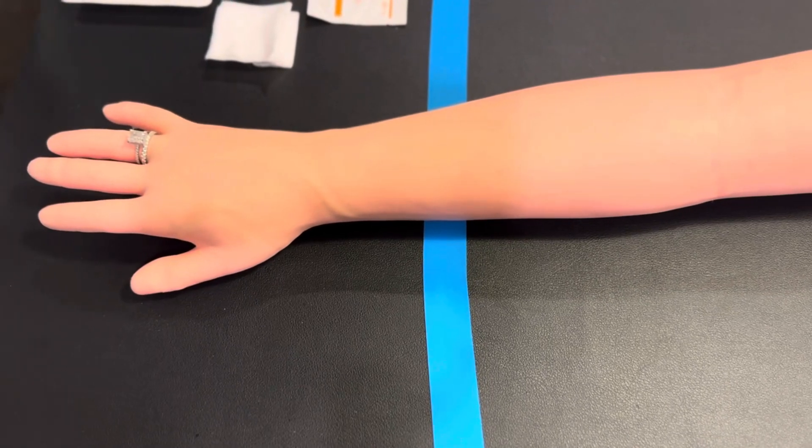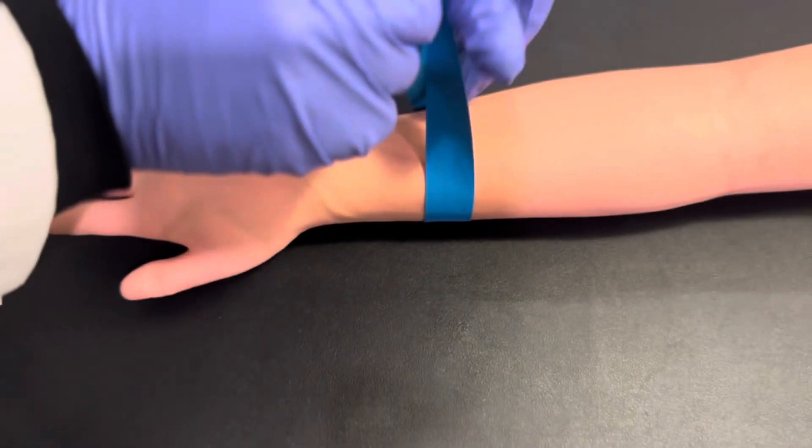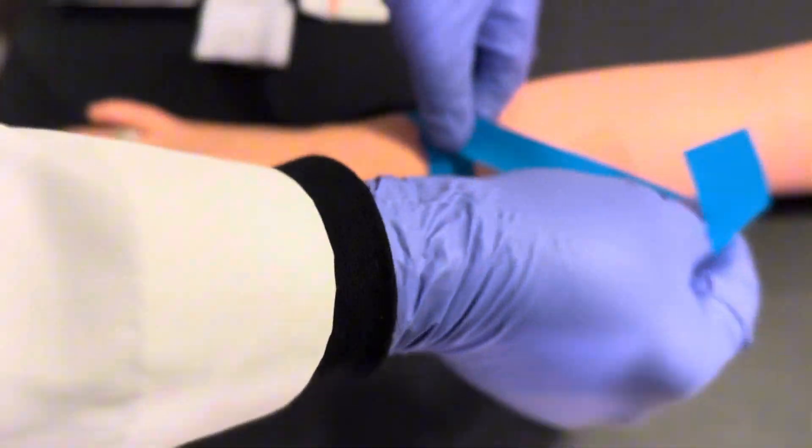Welcome to another segment of Mastering Phlebotomy. Today we're going to focus on how to anchor veins for venipuncture and IV therapy procedure.